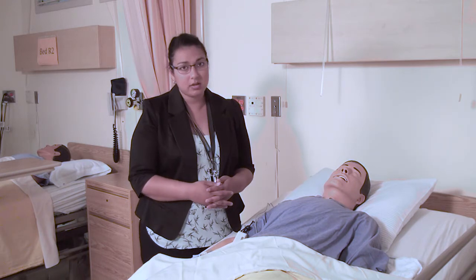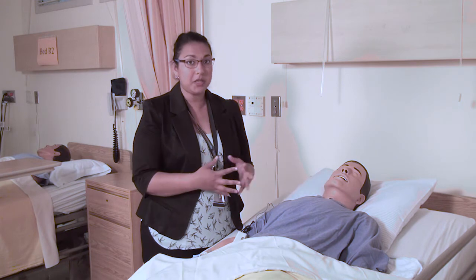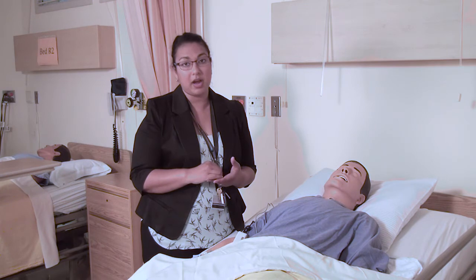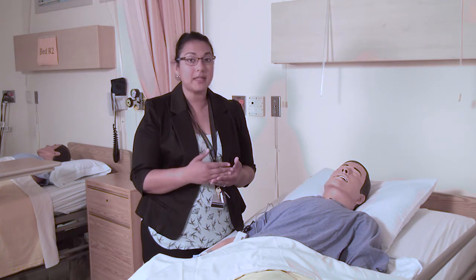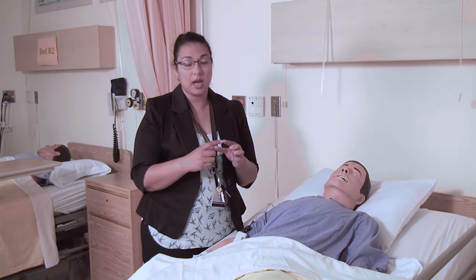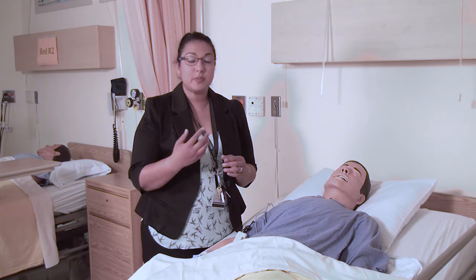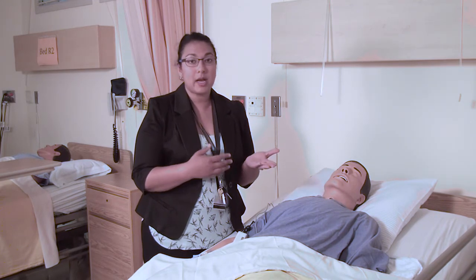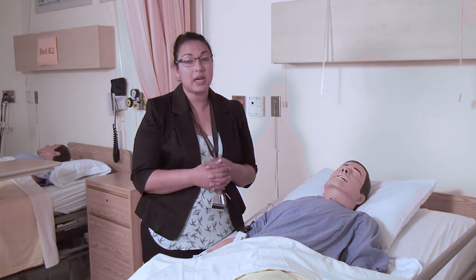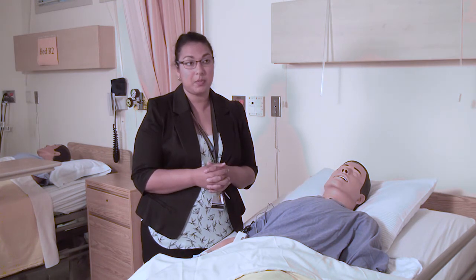So some of the common errors that happen with PCA reconstitution and dilution and administering is if the nurses don't understand the drug concentration and how to read a monograph. So it's really important that you really have a good grasp on how to read a monograph and how to reconstitute the drug itself into either a syringe or into a mini bag. If it's programmed incorrectly, so micrograms for milliliters or milligrams for milliliters, the final concentration, that'll make a really big impact on how much medication is being administered to the patient.